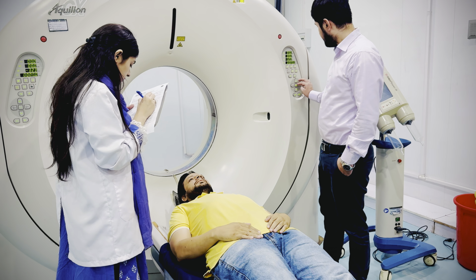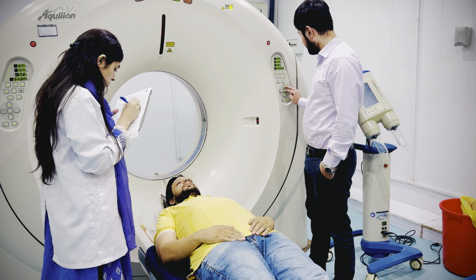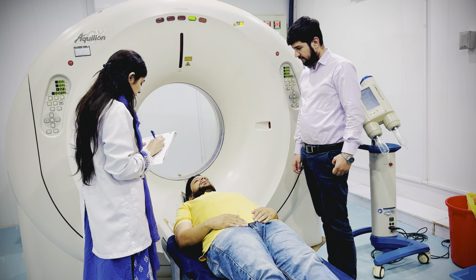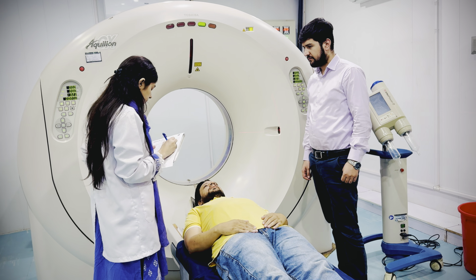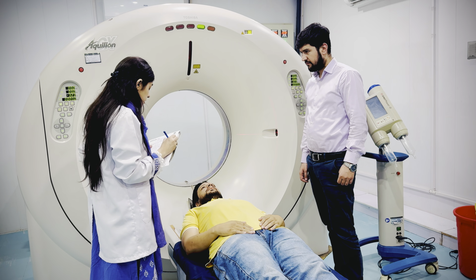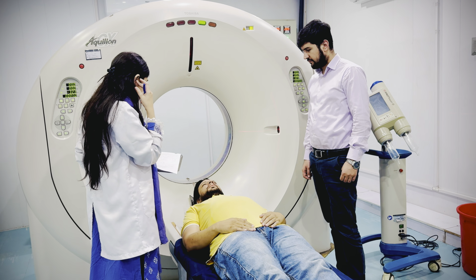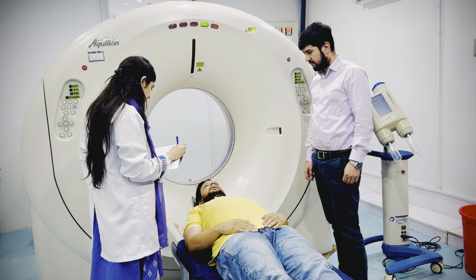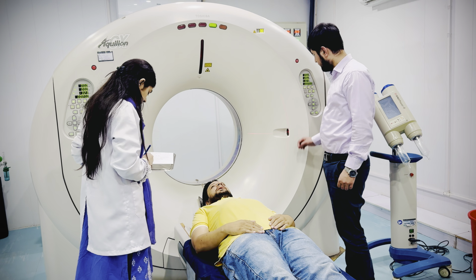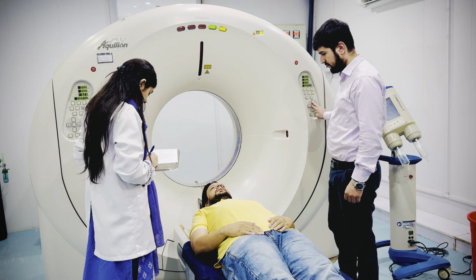Today we're going to see how a CT plain brain is going to be performed. First and foremost, we start with the patient preparation. Firstly, confirm the patient's identity. Check the doctor's prescription, whether it's plain brain or anything else, and the diagnosis. Explain the procedure to the patient. Remove all metal objects. Get consent taken from the patient and take the history of the patient.